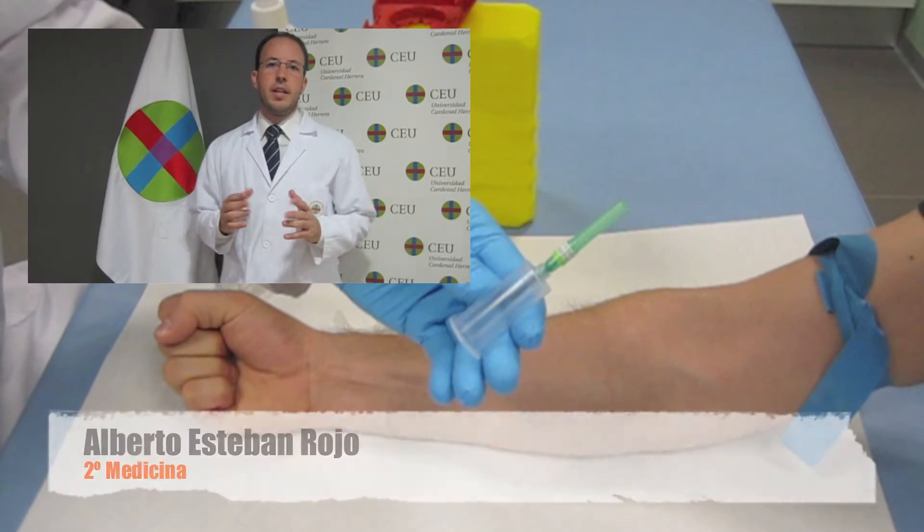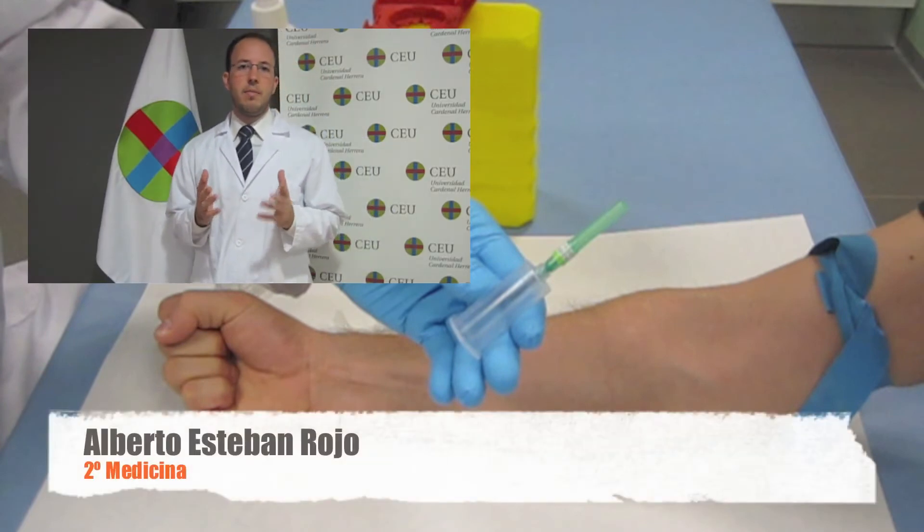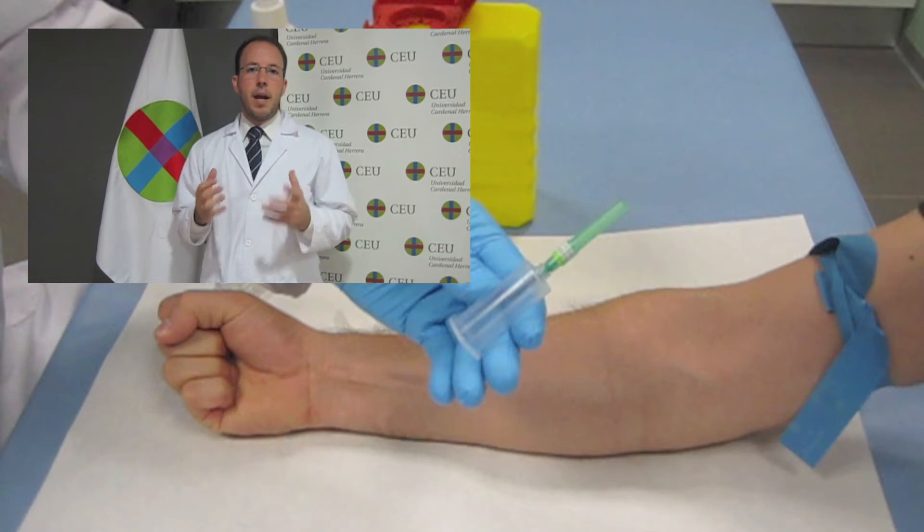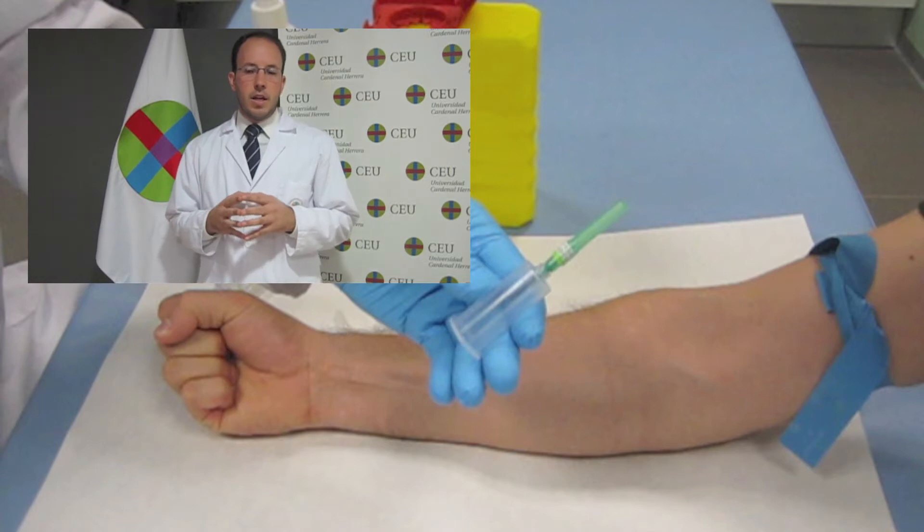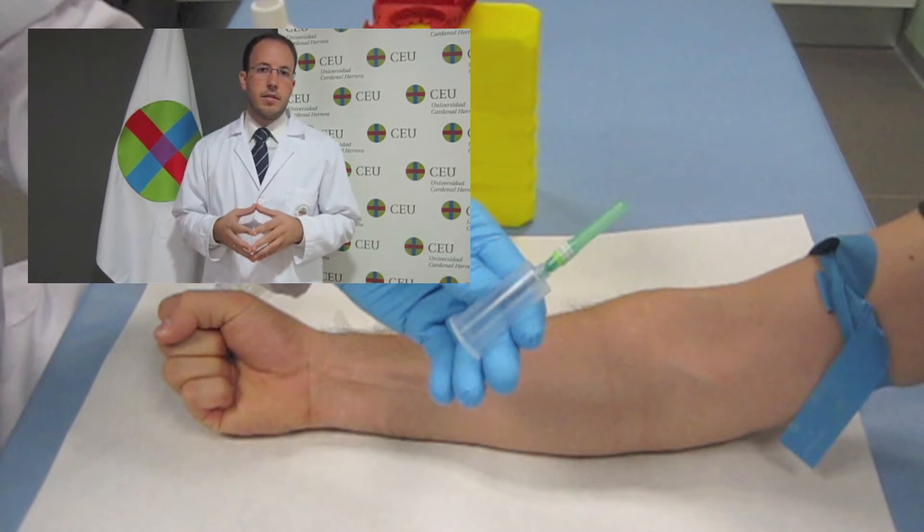Es importante la correcta elección del material cortopunzante para evitar la manipulación excesiva tanto de la muestra como de dicho material. Una vez realizada la extracción procederemos a tirar en el correspondiente contenedor dicho material para evitar accidentes.